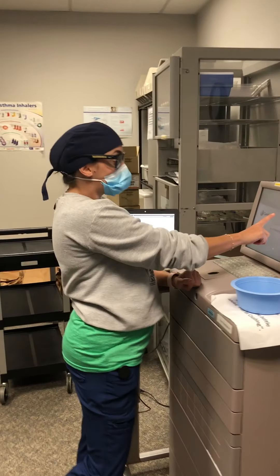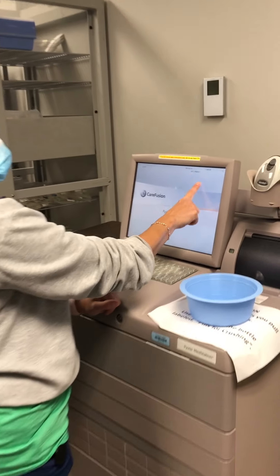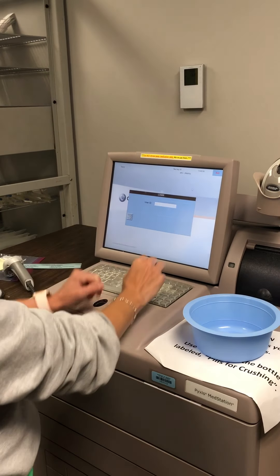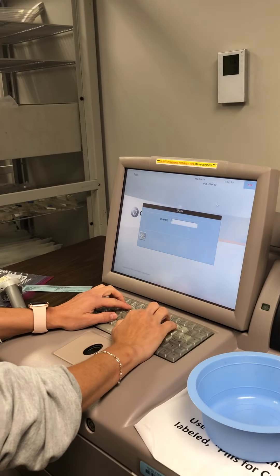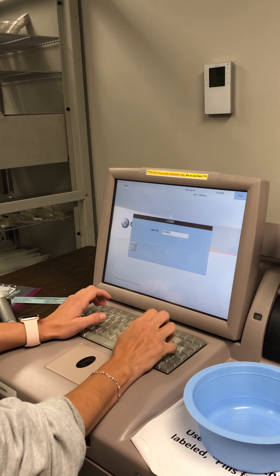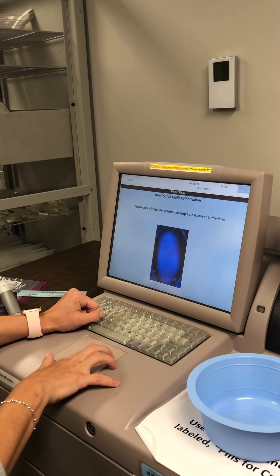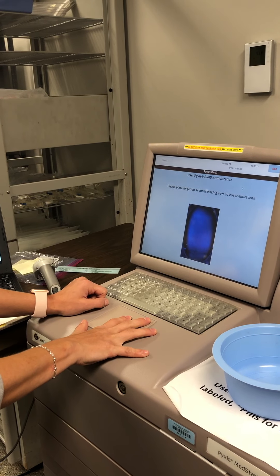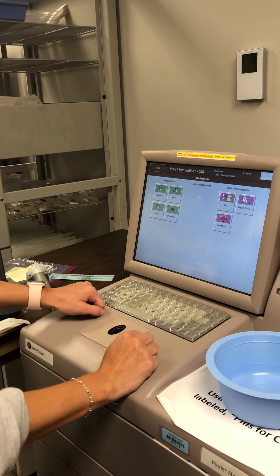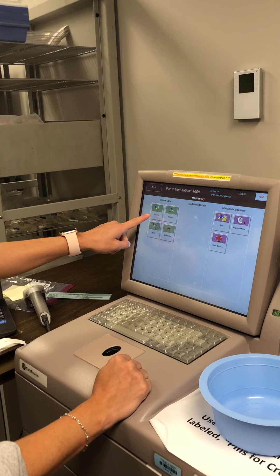I'm going to start by getting into the Pyxis. To get in, all you have to do is press anywhere on the screen and your user ID will come up. This will be the last five numbers of your SAP number. We should be ready with fingerprint set up so you can use your fingerprint to log in, and then we're going to use Remove.